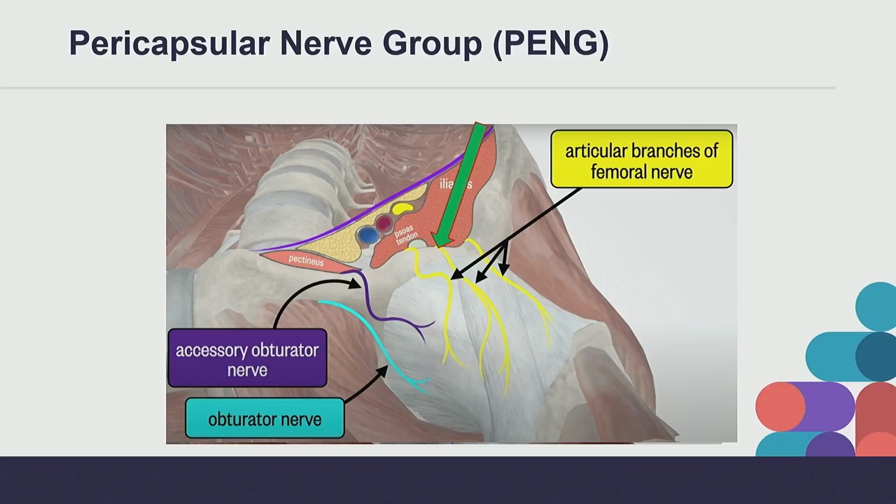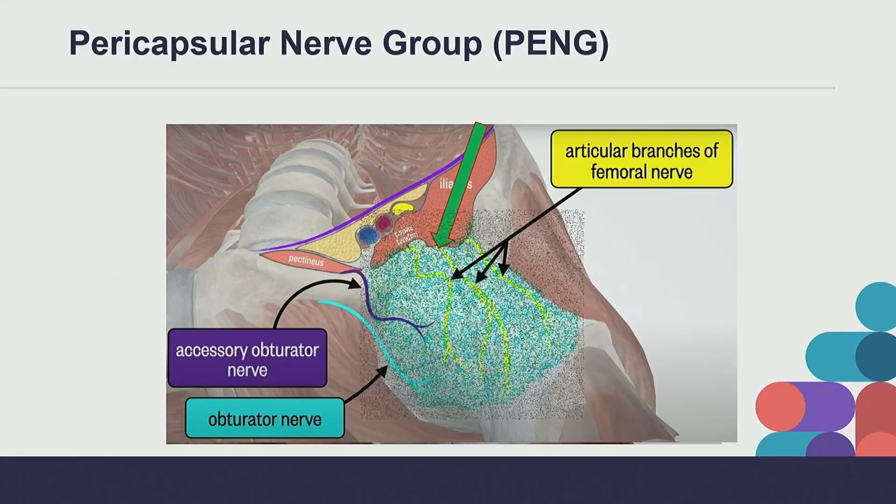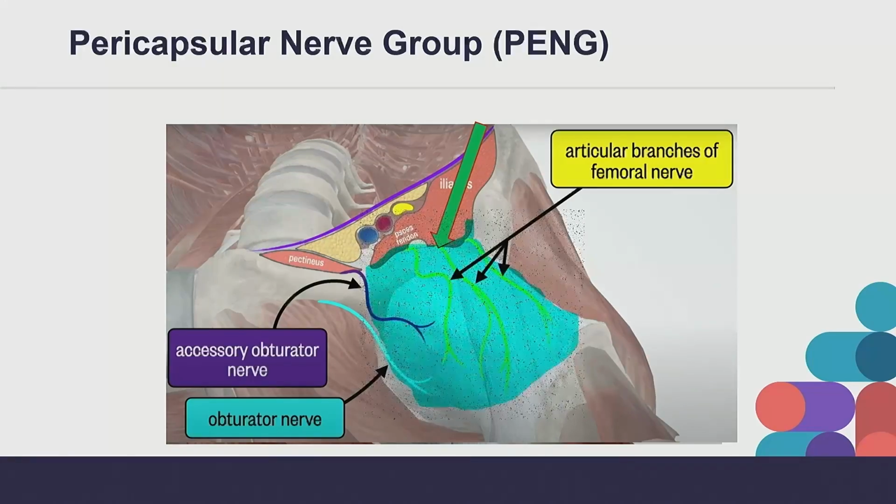And so when your needle comes down and touches down right on that trough of that pelvic brim, you get spread of local anesthetic that not only spreads medial laterally that you would see on the ultrasound because we're dealing with a 2D structure, but also cranial caudally along that pelvic brim, giving you nice coverage of those terminal branches.